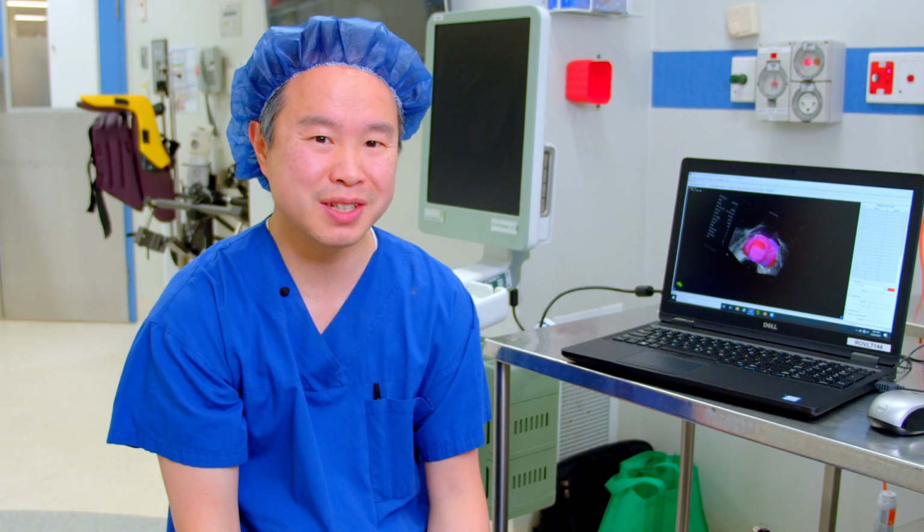With imaging, such as the PEDAL trial, where the patient gets an MRI and even a PSMA PET prior to biopsy, we have the advantage of seeing any abnormalities inside the prostate before we do the biopsy.